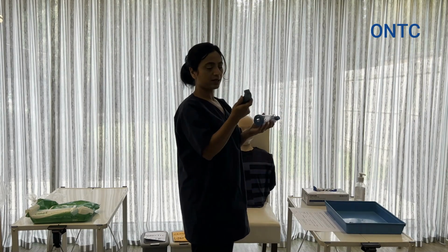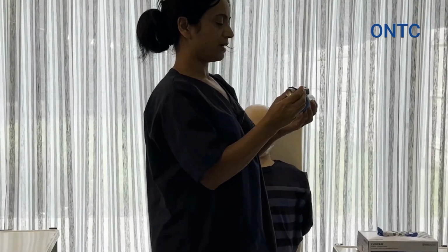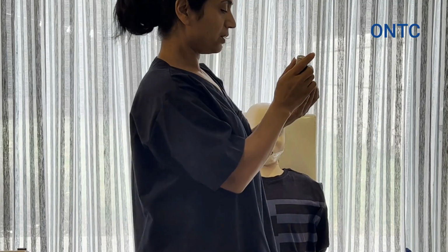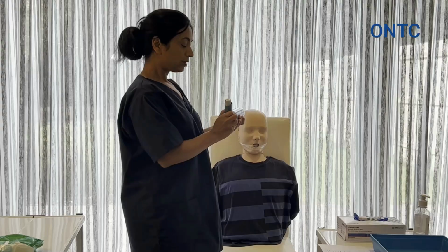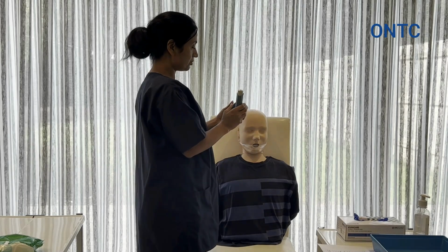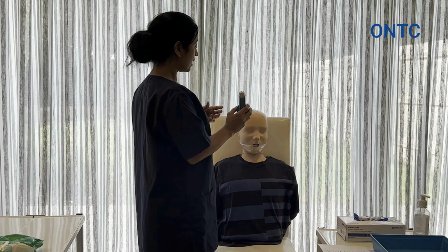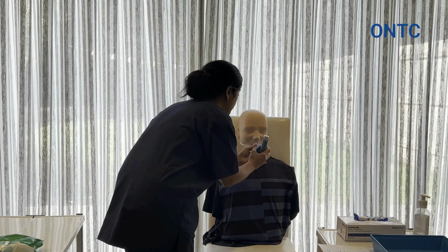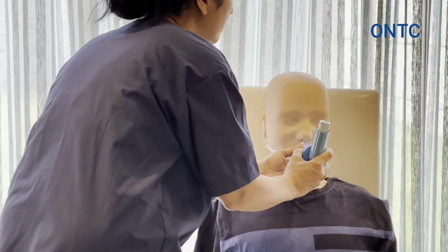So I'm just going to shake the inhaler for 2 to 5 seconds. So 1, 2, 3, 4, 5. Going to put it back in here. Okay, so we attach your inhaler to your spacer device. You're sitting upright, that's good. And now just exhale completely, okay, and then grab the mouthpiece into your mouth, make a seal, and start breathing deeply in and out.